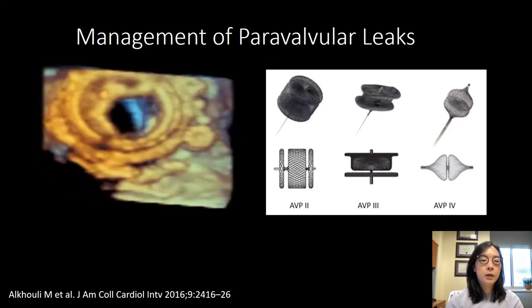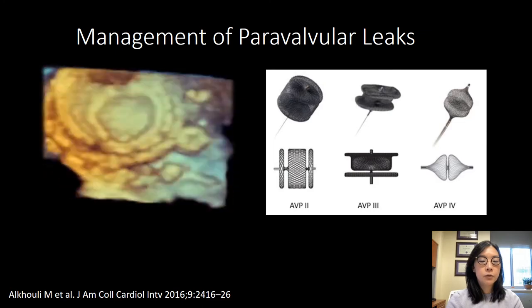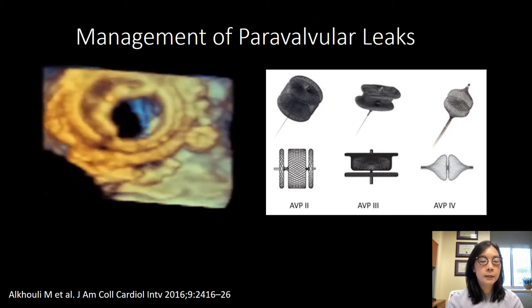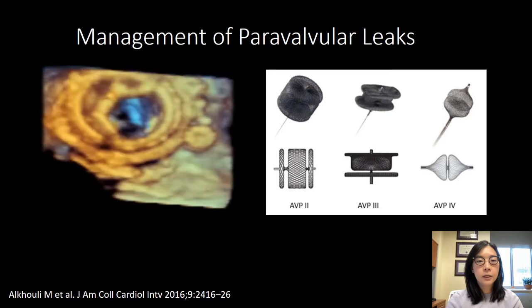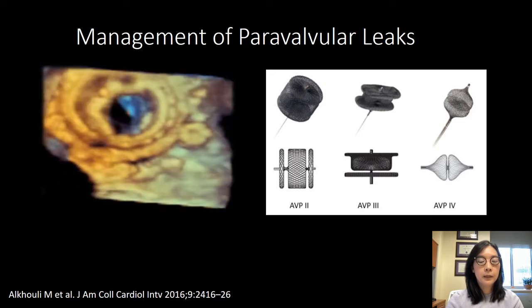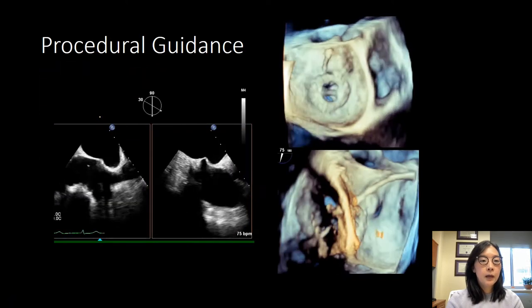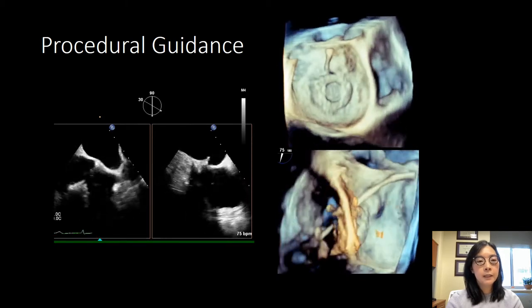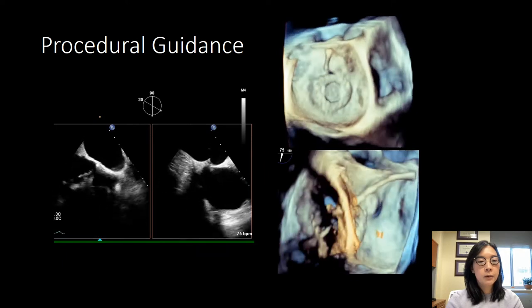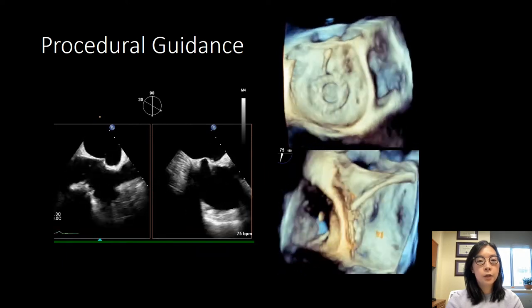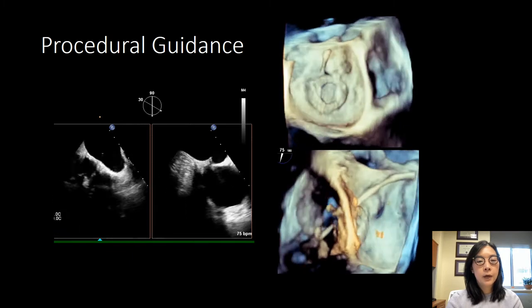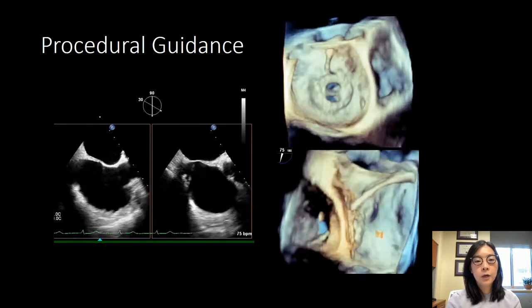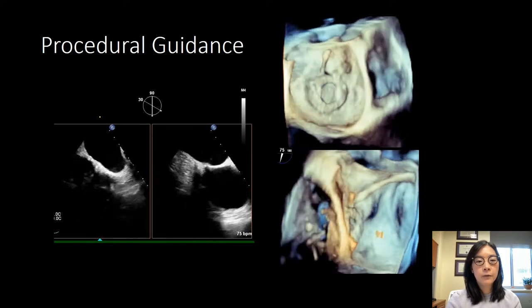We have many percutaneous options now for paravalvular leaks and so many patients instead of going straight for surgery are undergoing percutaneous procedures. Here is an example of a mechanical valve with a percutaneous device in place, along with a series of different percutaneous devices. 3D echocardiography, in addition to assessing severity and location, is useful for guiding procedures — here we see guidance of the transeptal puncture and then the catheter with the wire going through the paravalvular leak located anteriorly in this mitral valve, with an off-axis view showing the path of the wire from the septum through the valve into the ventricle.